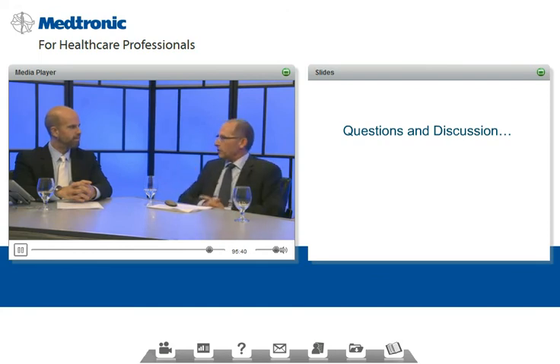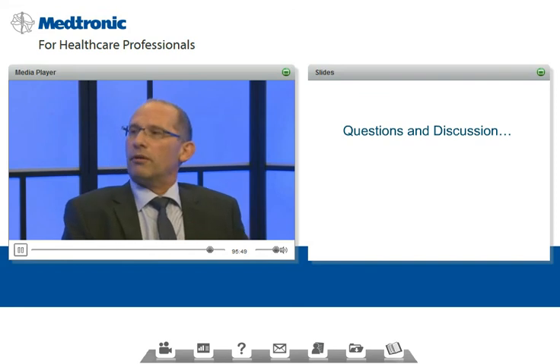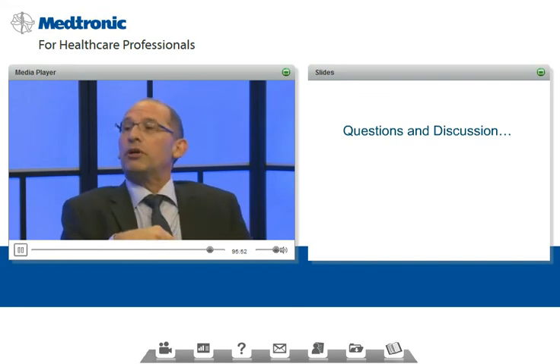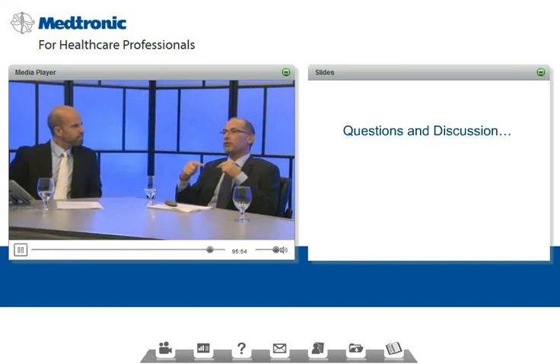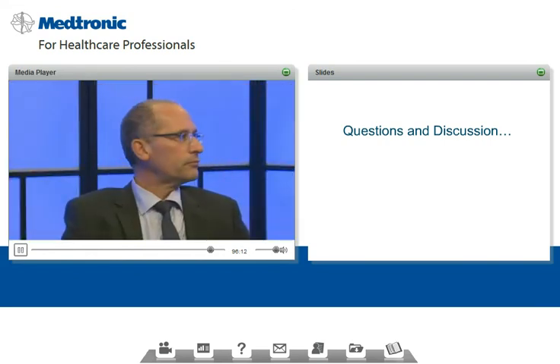But to follow up on that important question, in this case, we didn't have time to look at the pump settings. We did not open all the alarms. Now that I'm pushing to a more aggressive treatment, I would make a point of opening the low glucose suspension and the low alarms to prevent what you're saying, because I cannot eradicate it. And if you try to eradicate the hypoglycemia in pregnancy, you're going to end up with more macrosomia and more large for gestational age.